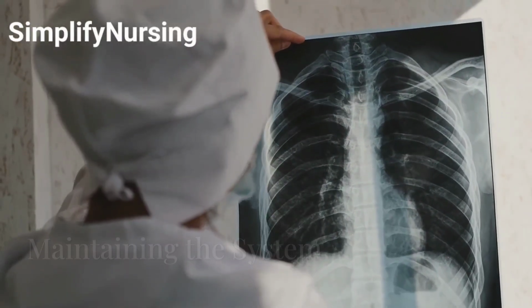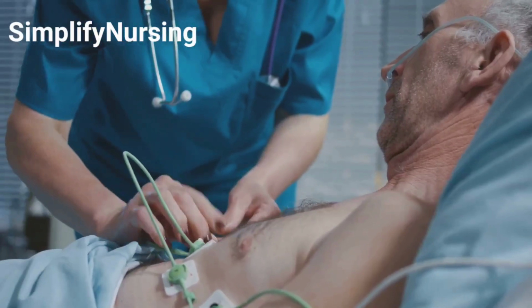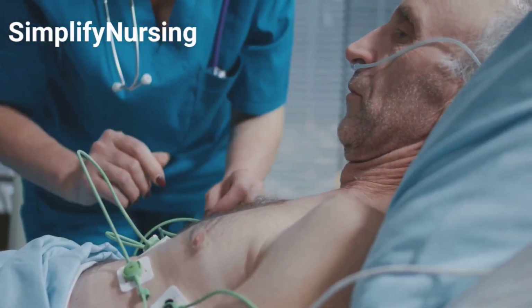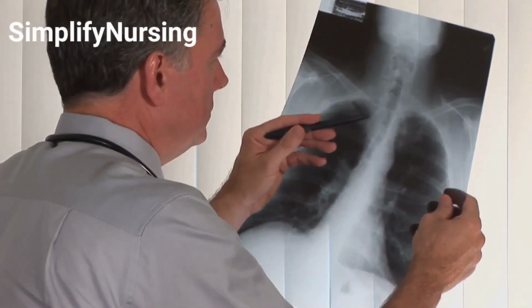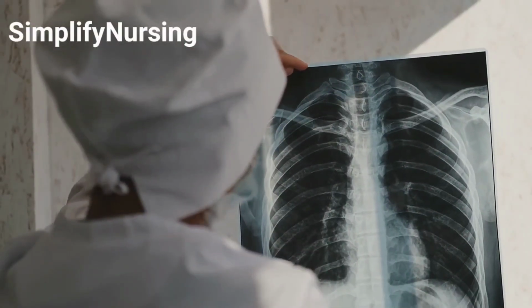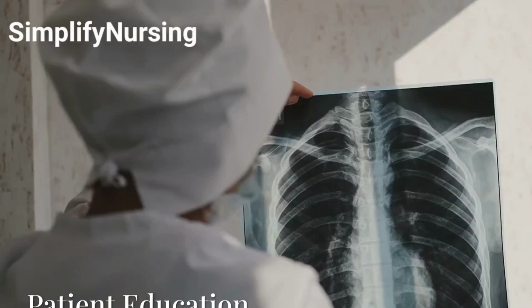Now, moving on to maintaining the system. First, always keep the drainage system below the level of the chest. This is really important. Make sure all connections are secure and taped. And remember, do not clamp the tube unless instructed by a physician.